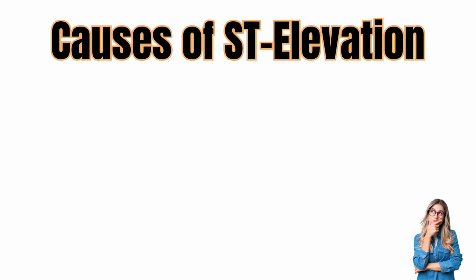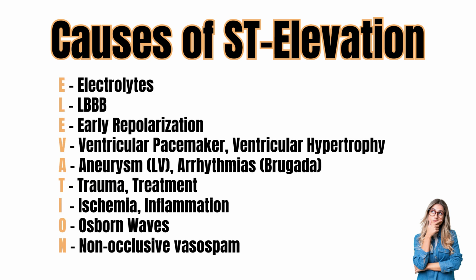Now, we know things aren't always what they seem, and ST elevation on an EKG isn't always a myocardial infarction. In fact, there are lots of other causes of ST elevation. And here's a handy dandy little mnemonic to help you remember what those causes are.